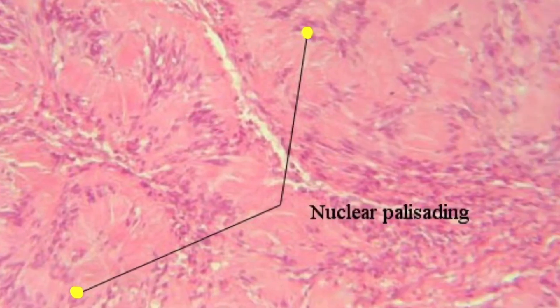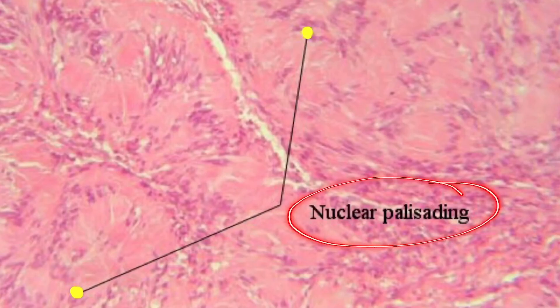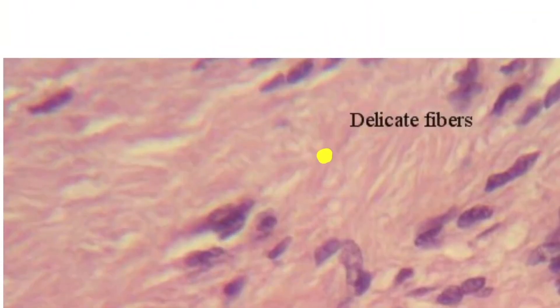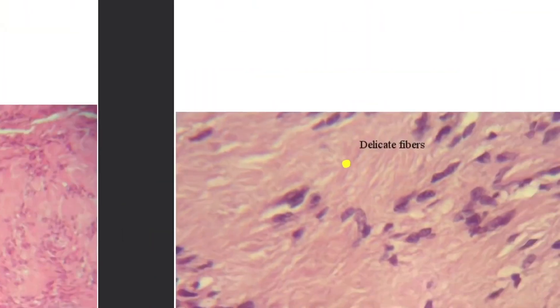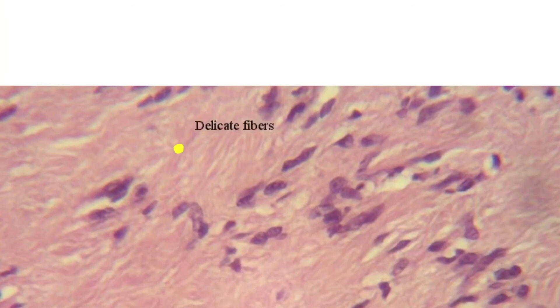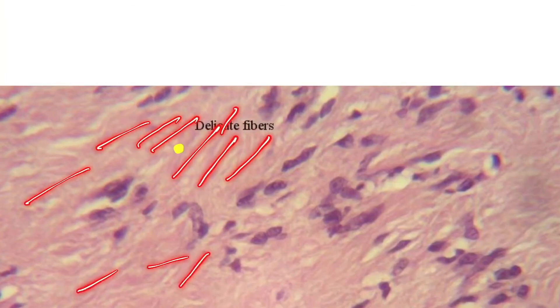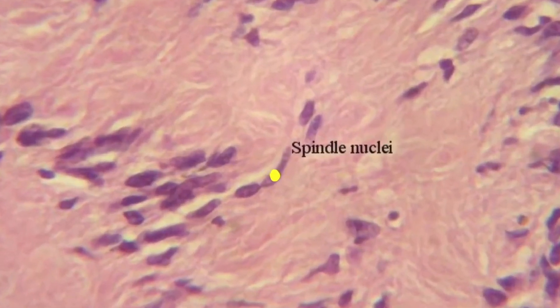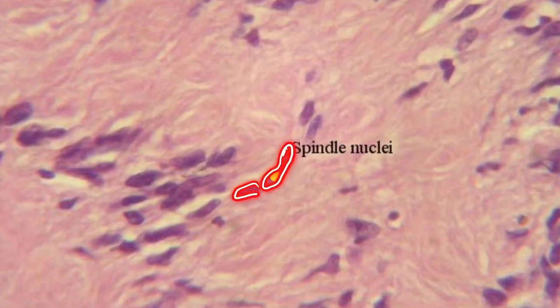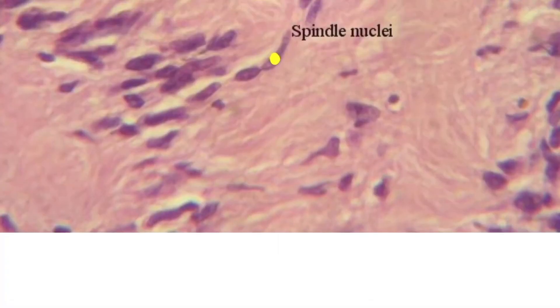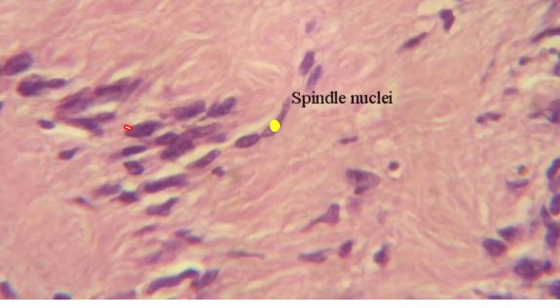These are called the nuclear palisading. And here you can see the delicate fibers - pink color fibers. The nucleus is spindle-shaped. Here you can see the spindle nuclei throughout. And this is a palisade.